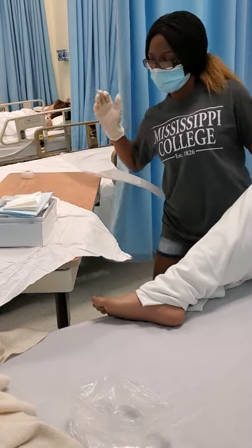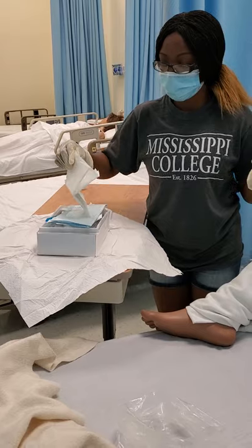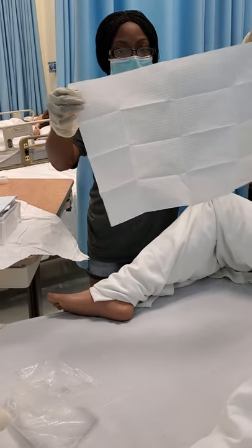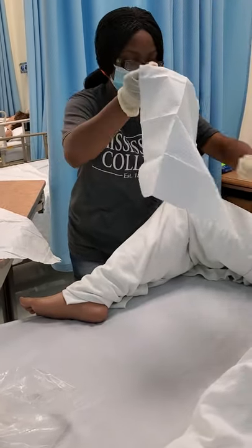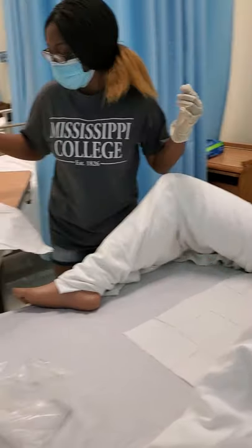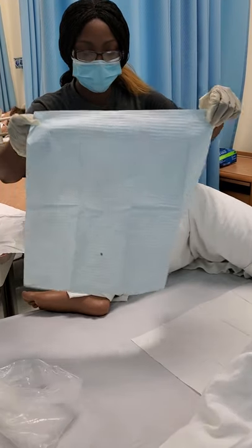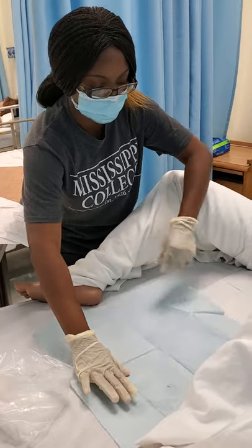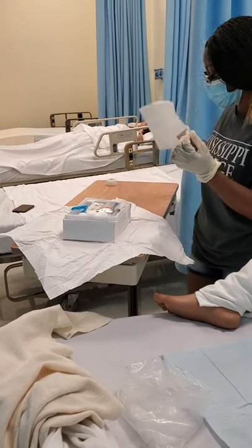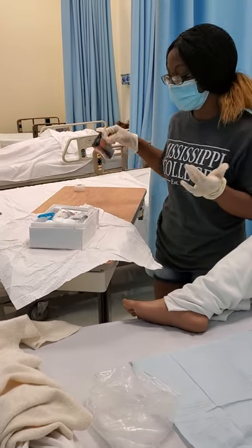Now I'm going to get rid of this. Okay. Now I'm going to set down my sterile field in the middle of the bed. Okay. With making sure that the shiny side is down. Same with this one. I'm going to make sure that the shiny side is down. Okay. Now I'm going to discard this because I do not need it. I'm going to get rid of this hydrogen peroxide because I don't need it either.